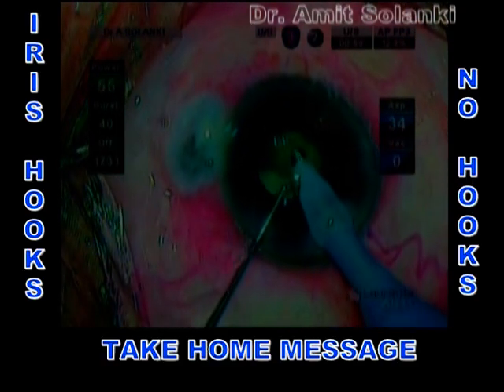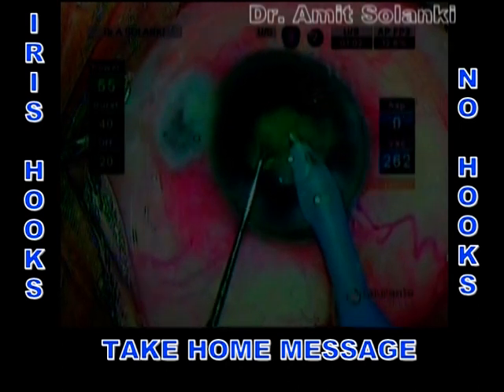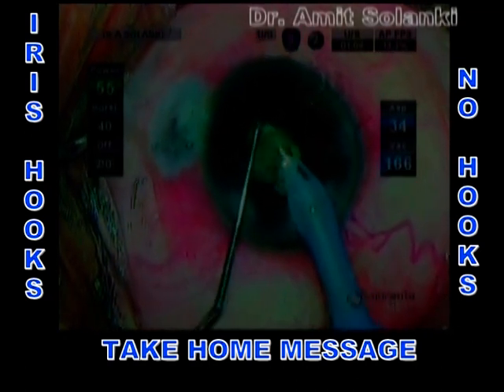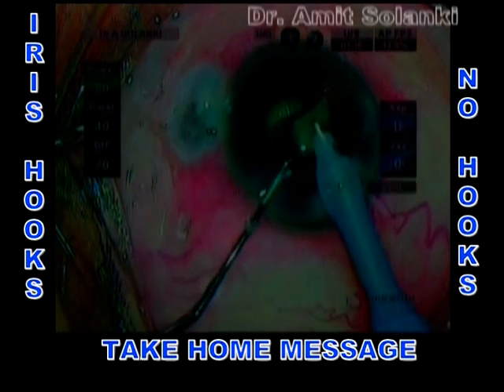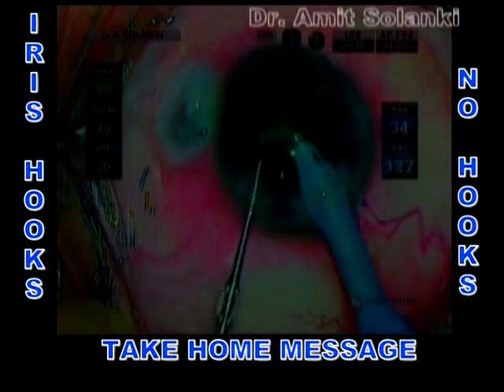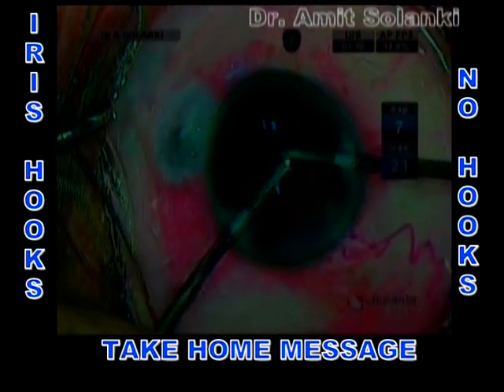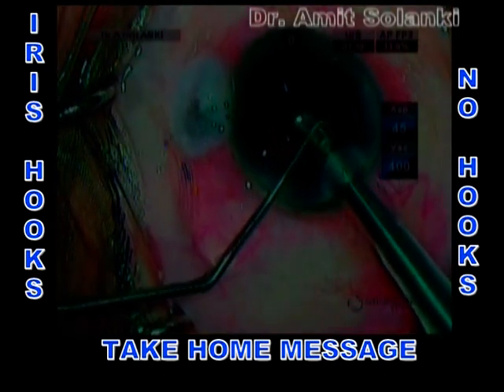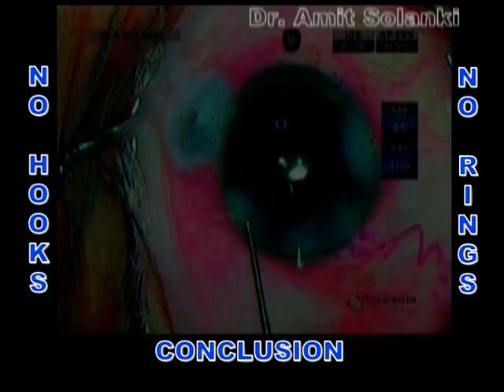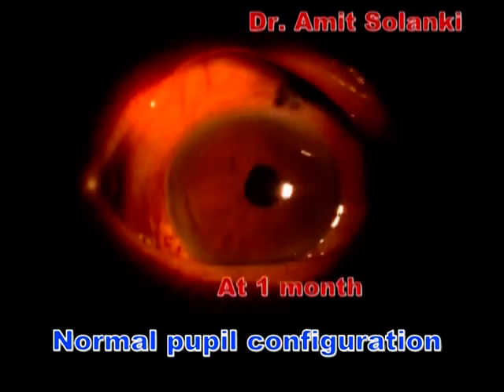The take-home message of this video: phaco in a small pupil is really challenging. Several intraoperative techniques and pupil-expanding devices like rings and hooks are available. Selection of the pupil-expanding technique depends on the surgeon's skill and preference and also on the individual intraoperative situation. However, in many cases, it may not be necessary to use pupil retracting hooks, which can cause permanent pupil distortion postoperatively. In conclusion, using the no-hooks, no-rings technique, normal pupil configuration can be achieved in a selected group of patients with minimum or no pupil widening manipulation.